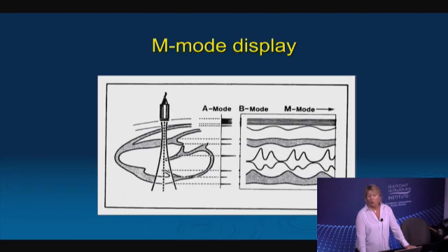And we can evaluate those accordingly. With M mode, we pick an area that we want to slice through and only look at that one little slice at one time in 1 dimension. You select a button on your machine called M mode, and it brings up a line, and you just use your trackball to place that line over the structure of interest.